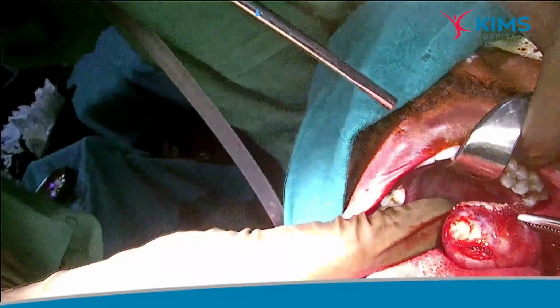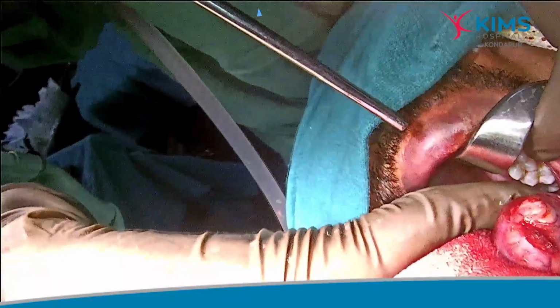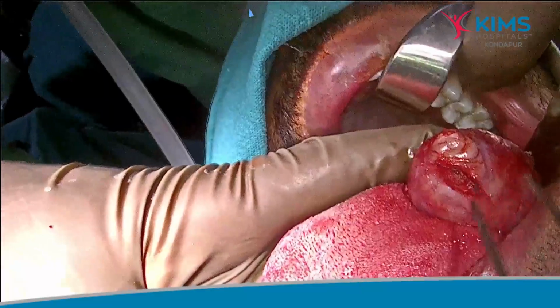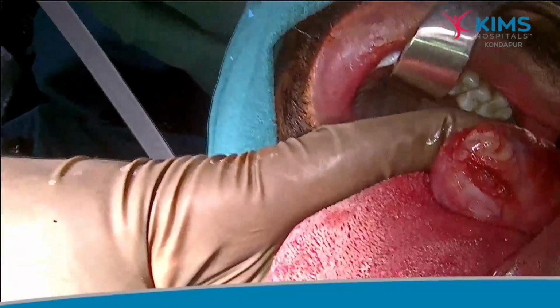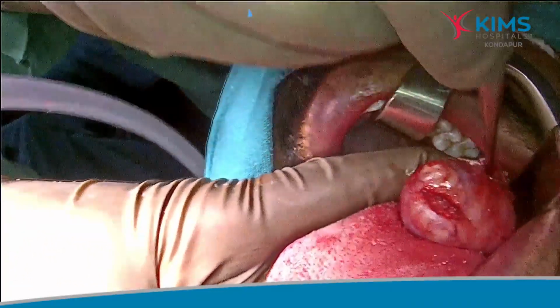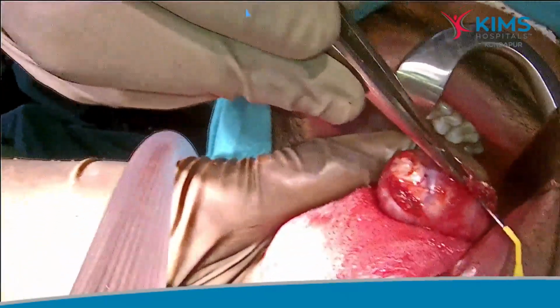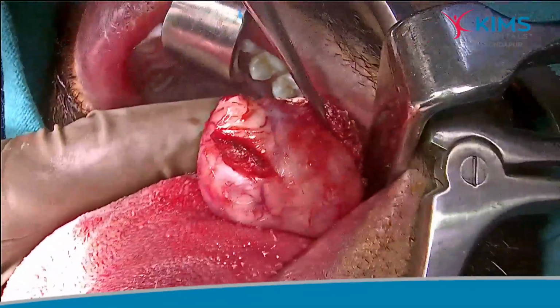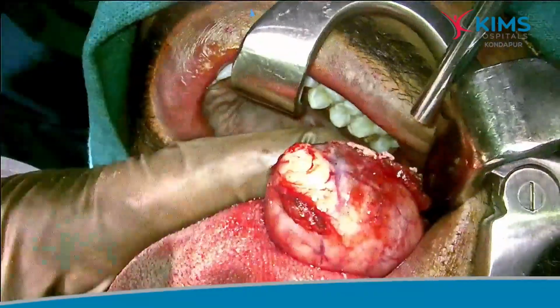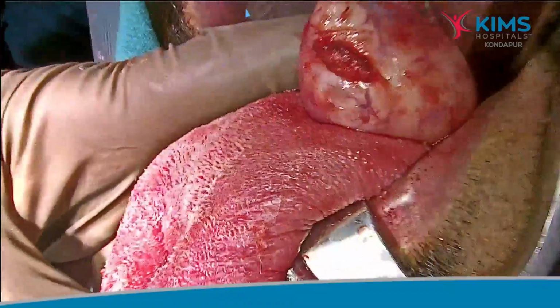As you can see, that is the superficial flap getting separated from the tumor. The base of the tumor has been completely removed and hemostasis secured well. The tumor is pushed anteriorly using 2 fingers. You can see there. And our idea is to secure the superficial flap so that it can be used for primary suturing.